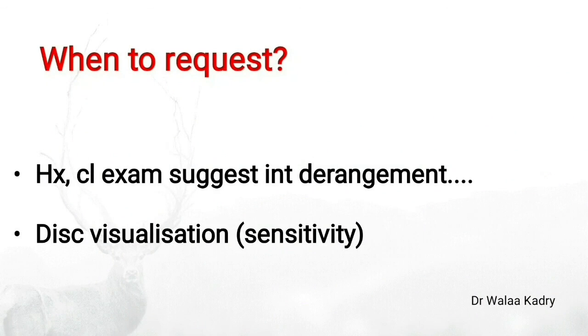So when history from the patient or clinical examination suggests internal derangement or intracapsular disorder, we request magnetic resonance image to visualize the disc, which can only be seen on MRI.